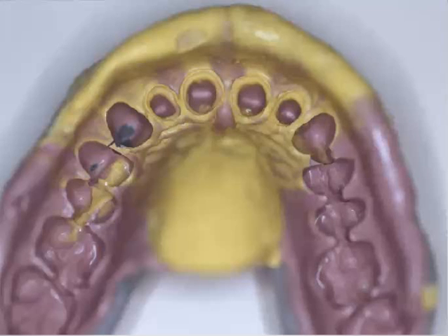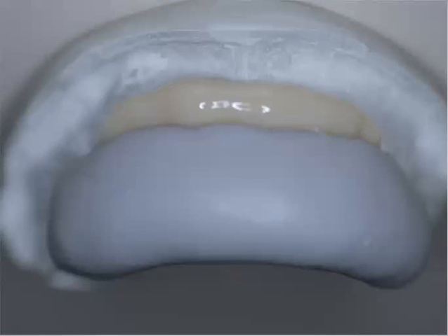And as I mentioned to you before, when you have multiple-unit fixed bridgework, it really behooves you to construct a custom tray. You get even distribution and even shrinkage of the material. We don't have any problems of burn-through, and there's easy margin identification and a very exacting, accurate model. As soon as we're done with the impression technique, at the same time, take a quick snap alginate. You can pour that up in quick-setting stone.